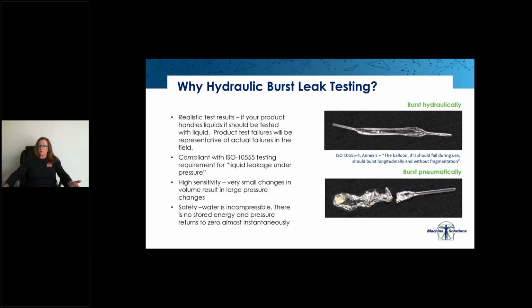Another reason is for regulatory compliance. ISO 10555 calls for liquid leakage under pressure. Hydraulic testing tends to be more sensitive than pneumatic testing, and very small changes in volume result in large pressure changes, making leak detection more sensitive. Last but not least is safety. Water is incompressible. There is no stored energy, and therefore the pressure returns to 0 almost instantaneously after an event.